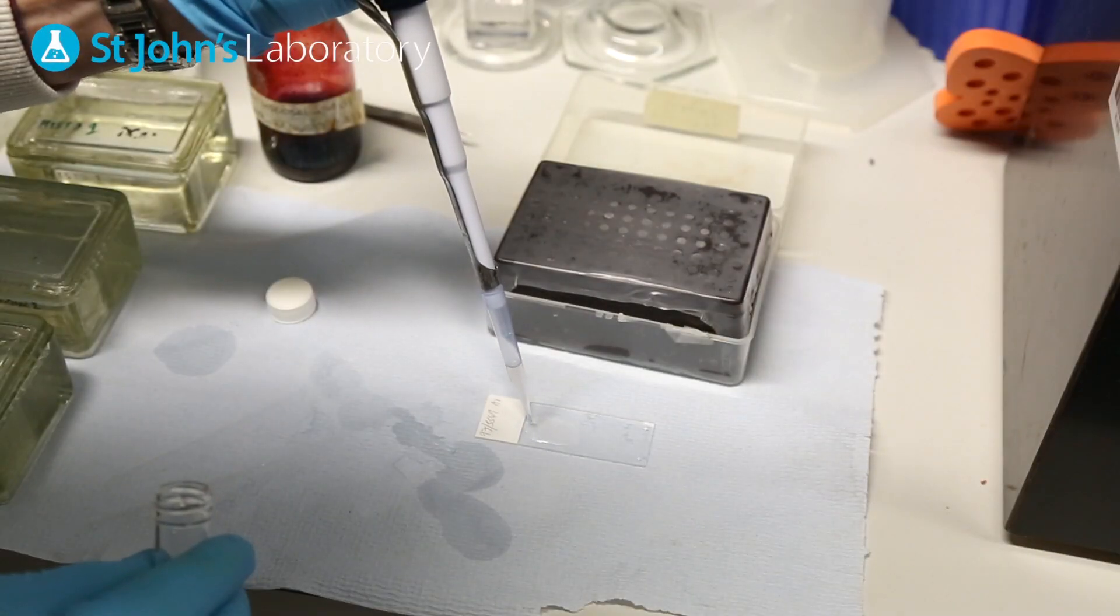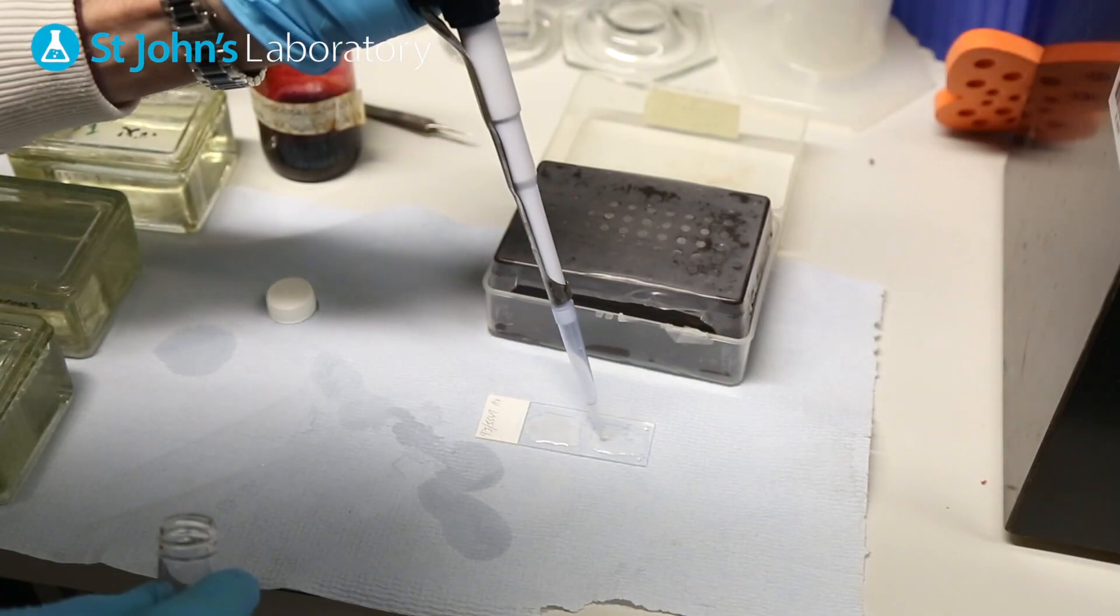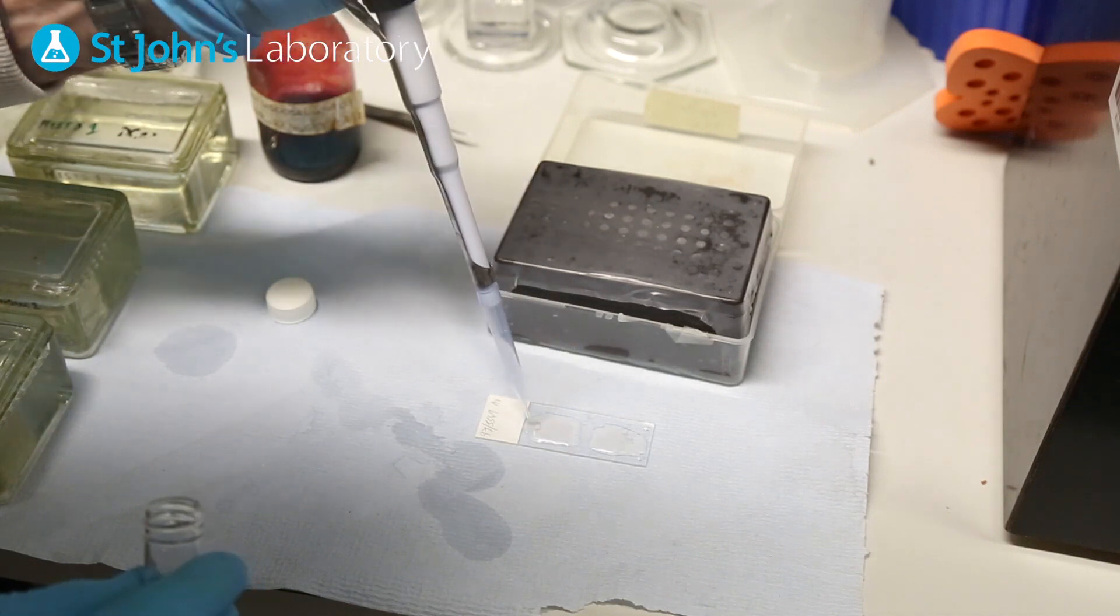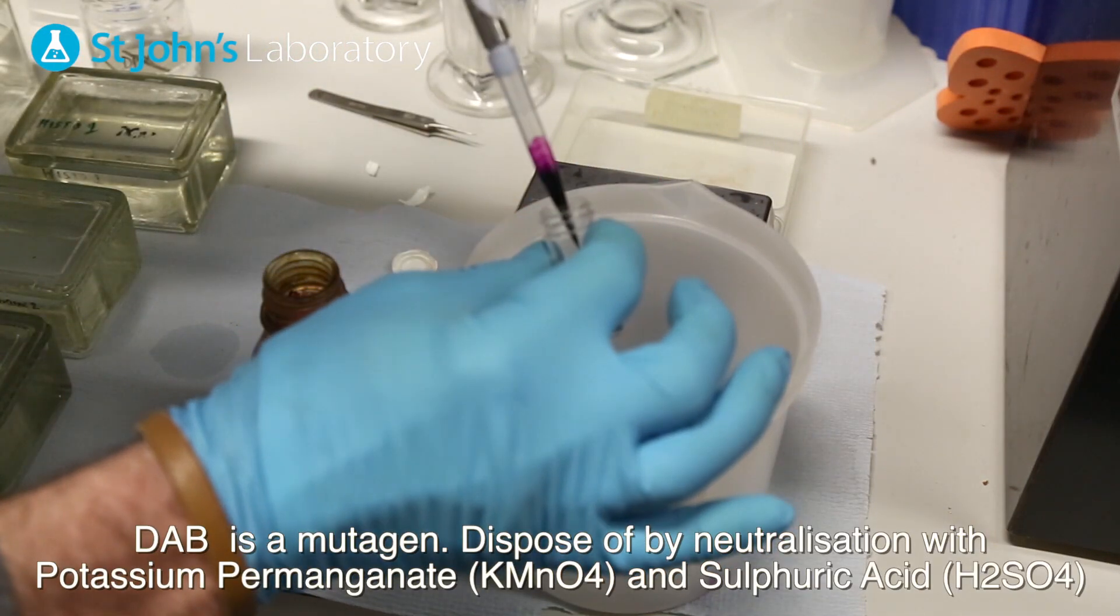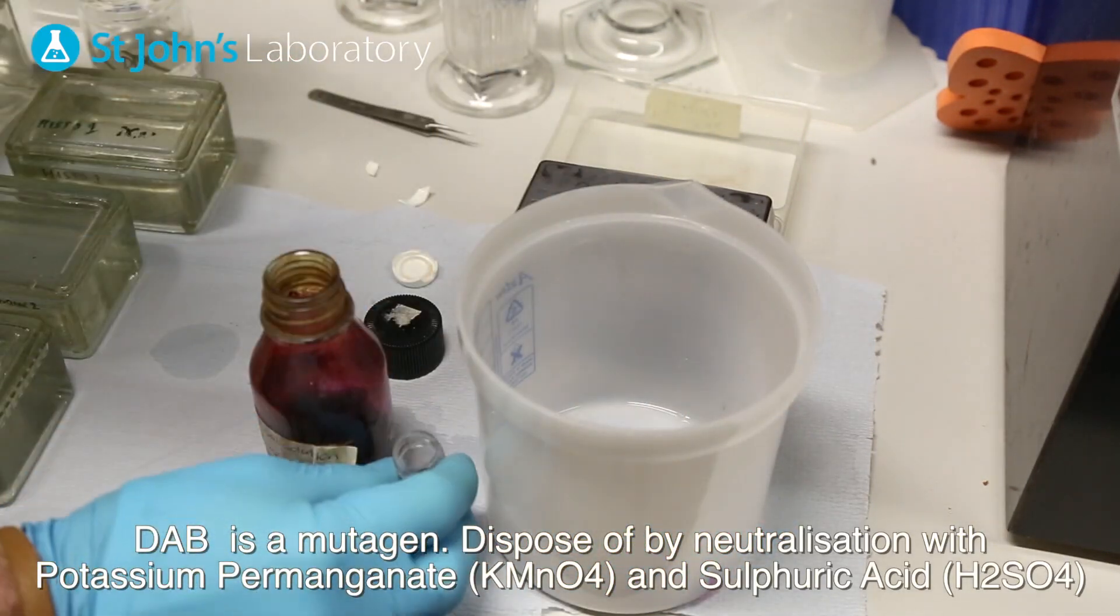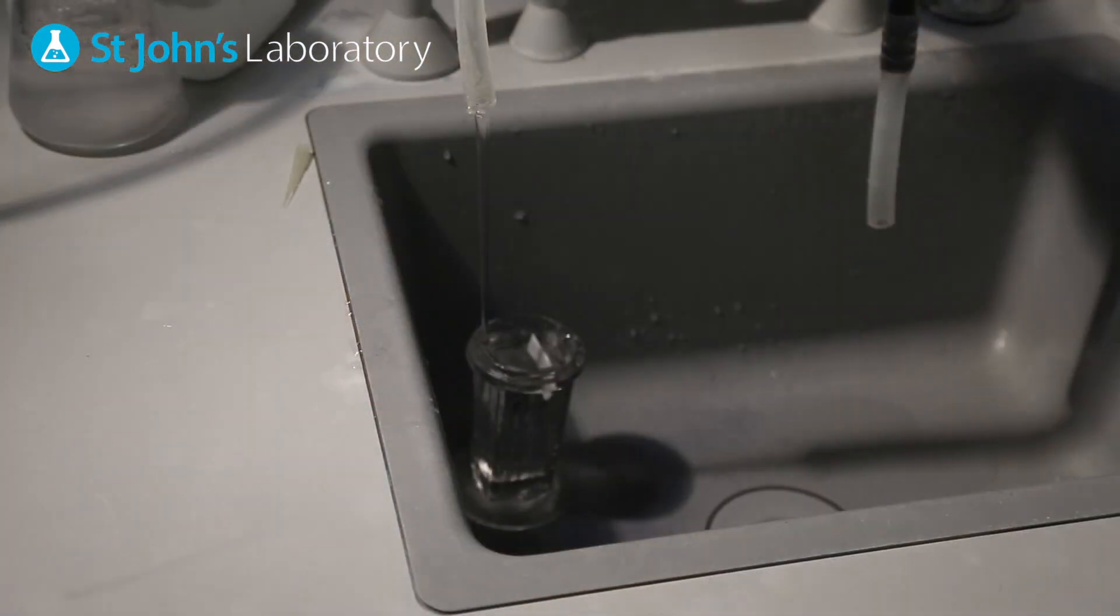DAB forms a brown stain when it reacts with HRP in the presence of peroxide. A 10 minute incubation should be sufficient to see this reaction and identify where the peroxidase conjugated antibodies are bound.